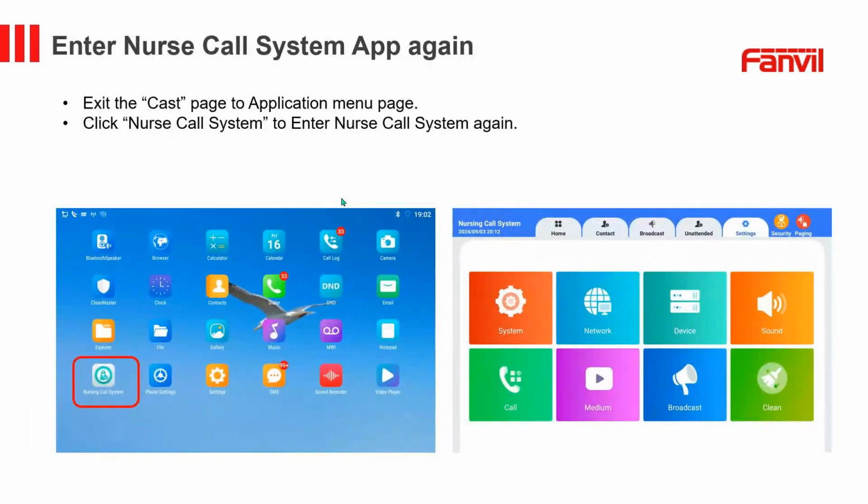After the screen mirroring is active, you can exit the cast settings and return to the Nurse Call System app. The cast screen will remain active until you disconnect your device from your TV.